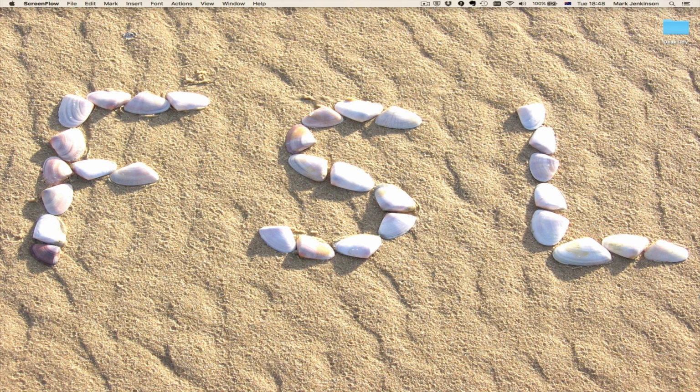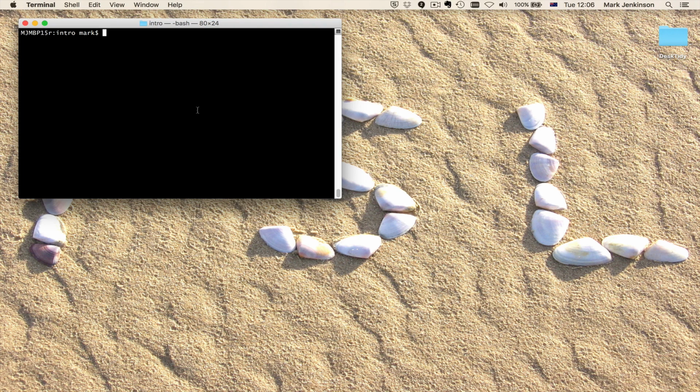Welcome to the third part of the introductory practical for the FSL course. Here we're going to look at some miscellaneous command line utilities, collectively called FSL utils.